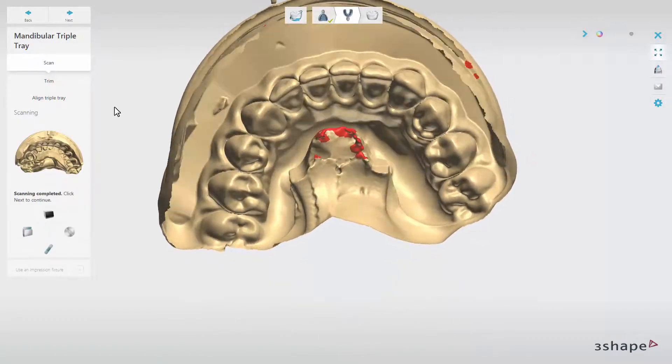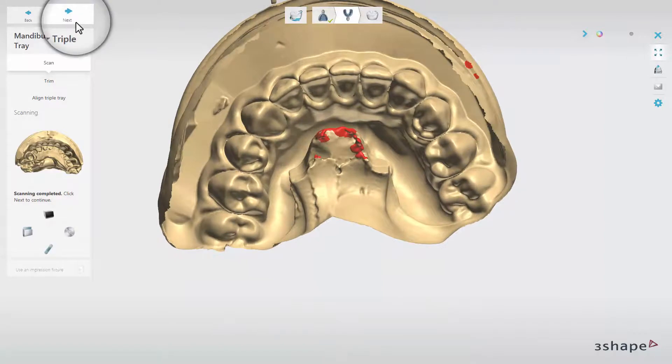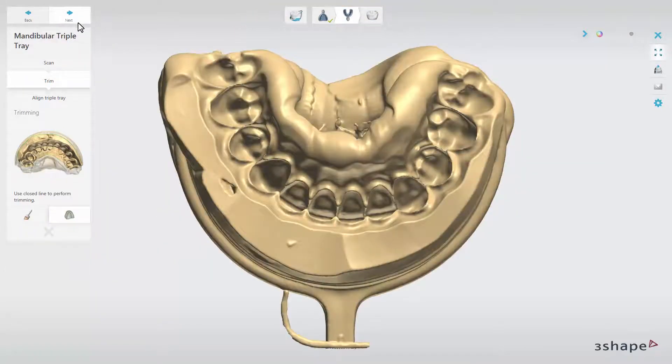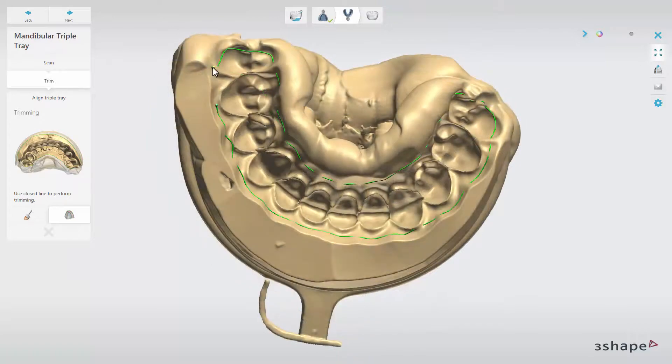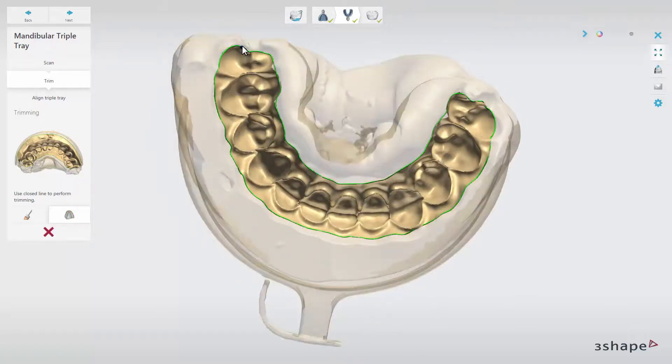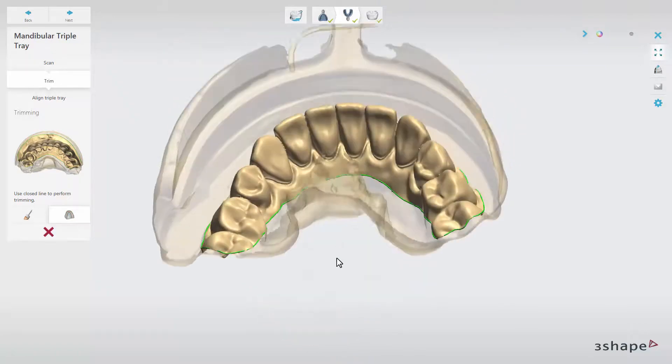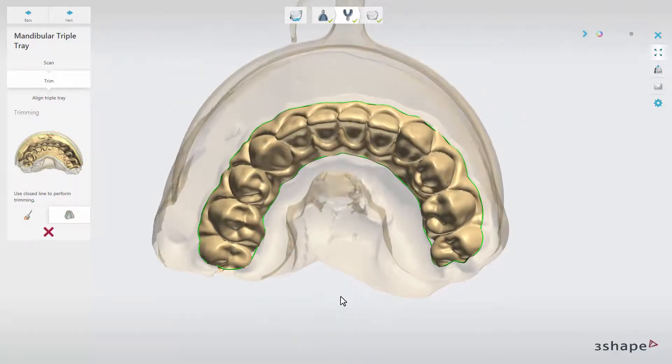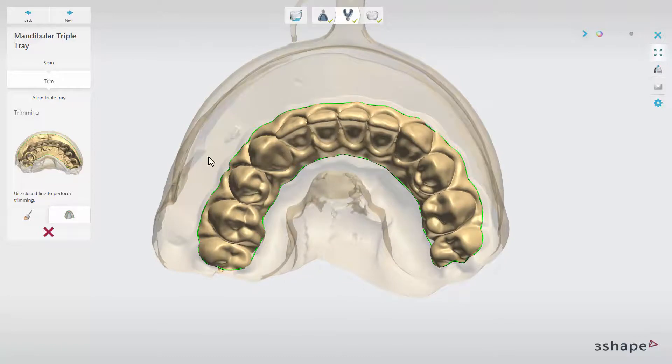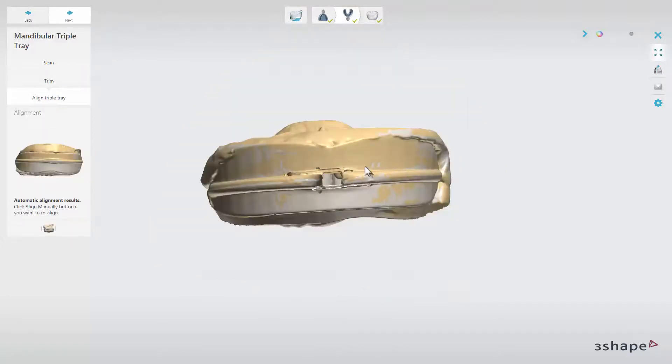Once the scan is ready, click Next to be able to trim it. When you have made your selection, click Next to move on to automatic alignment of both scans.